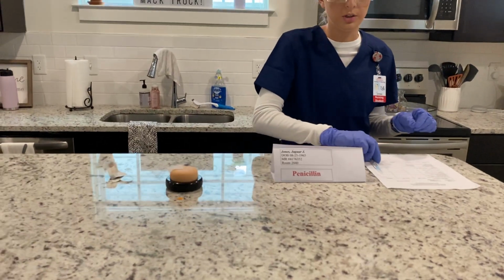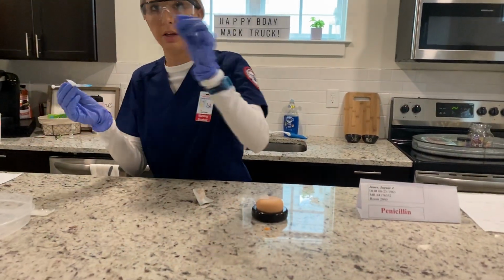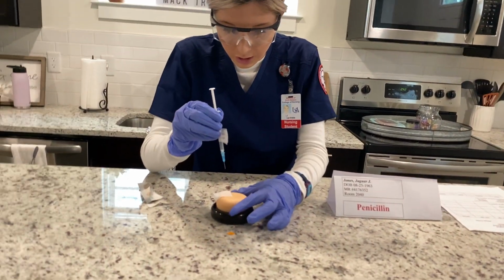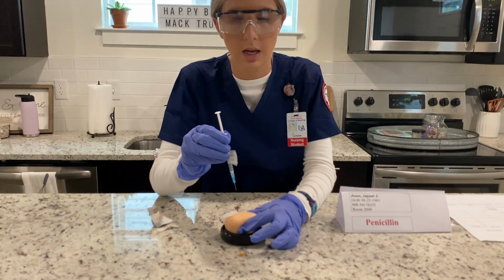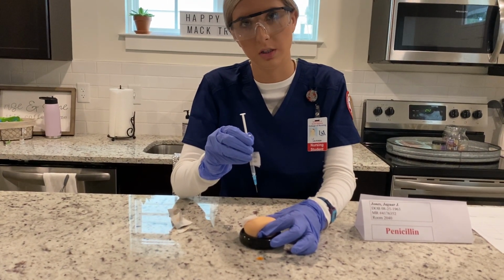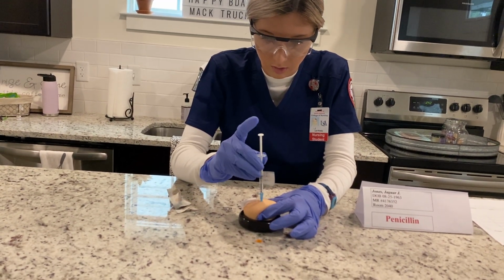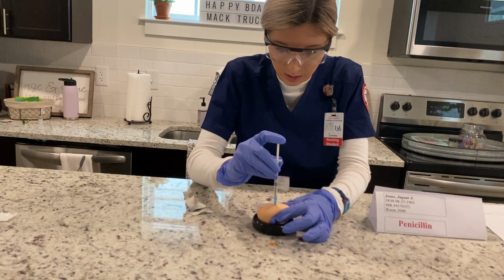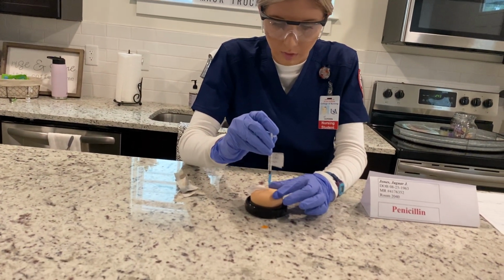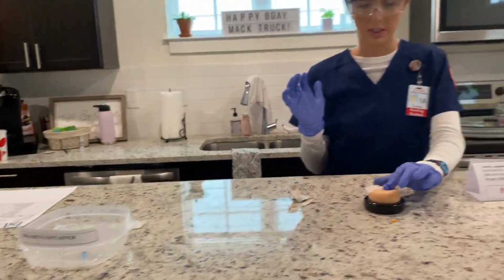And then I'm going to uncap my syringe and put the cap in the sharps container, and then I'm going to push up 2 inches of skin and go at a 90-degree angle. If I wasn't allowed to push up 2 inches of skin, I would do a 45-degree angle. So I'm gonna do the 90-degree angle, and then I'm going to inject the medicine and pull out and apply gentle pressure and put my syringe in the sharps container.